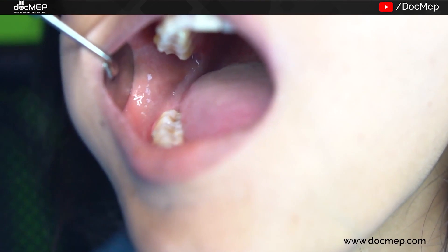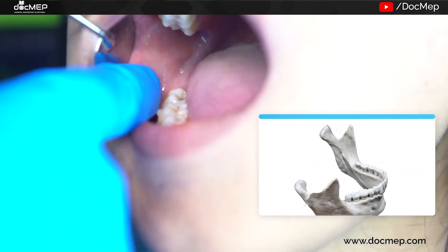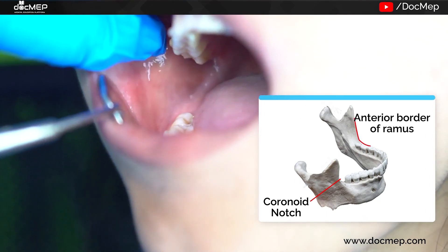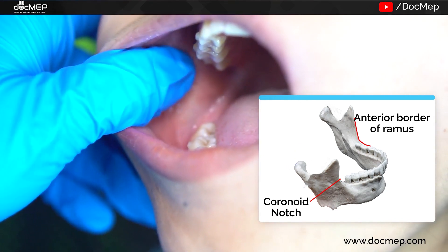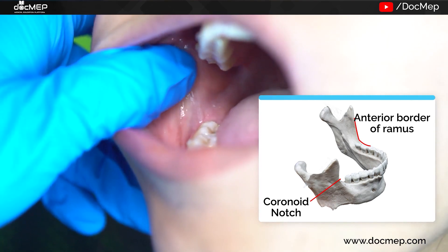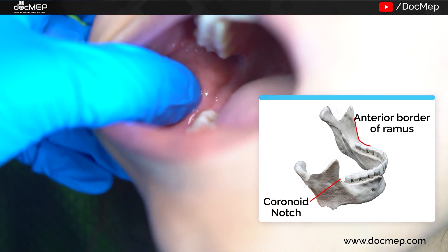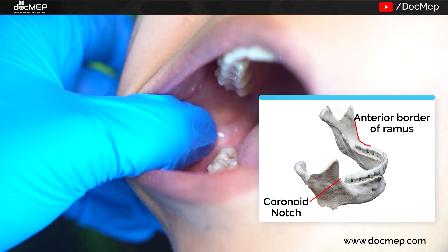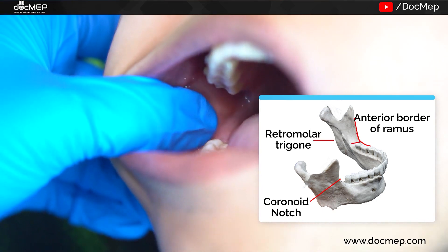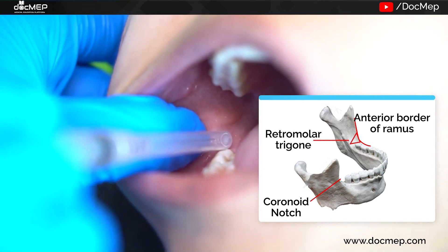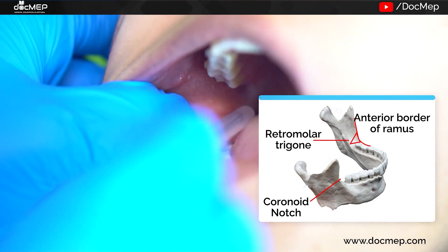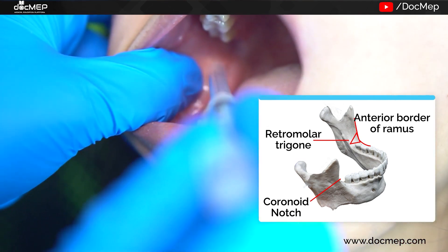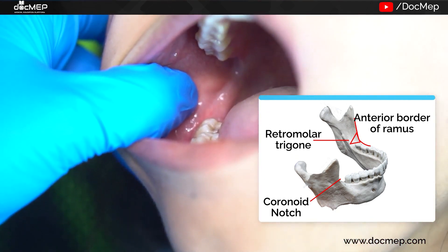In order of palpation, the landmarks are identified starting with the mucobuccal fold. The anterior border of the ramus of the mandible can be palpated in the patient, and on the skull this is the anterior border of the ramus — the deepest portion is called the coronoid notch. Then the external oblique ridge, the internal oblique ridge, the retromolar trigon, the pterygomandibular ligament, the buccal sucking pad, and finally the pterygomandibular space — which is the space where your needle should enter to inject the solution.